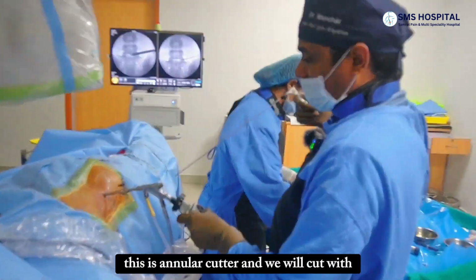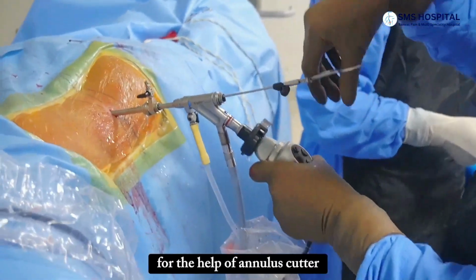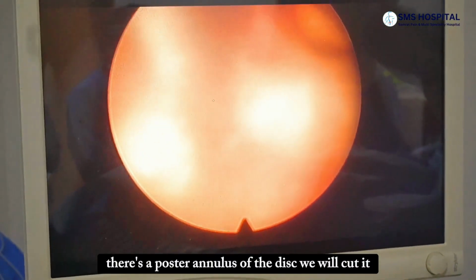This is the annular cutter, and we will cut with the help of the annulus cutter. There is a posterior annulus of the disc. We will cut it.